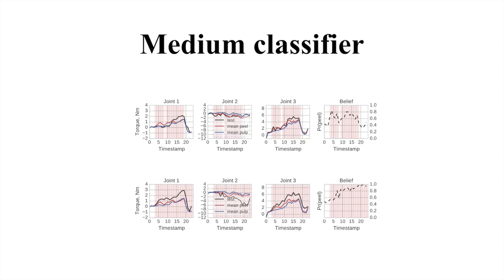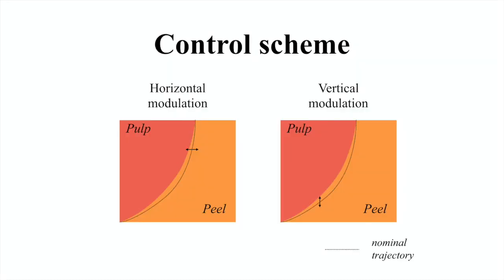One of the main criteria for the medium classifier in our task is to report the appropriate levels of uncertainty without committing to overconfident predictions. We found a linear logistic regression model a suitable candidate with a well-calibrated probability output. Despite misclassifying some intermediate samples, the trained model does not commit to any extreme beliefs over the mediums unless the torque is a strong representative of a given class. Importantly, in the case of ambiguous inputs, the model demonstrates desirable levels of uncertainty, which is extremely important as we use probability as an error signal in the feedback control.